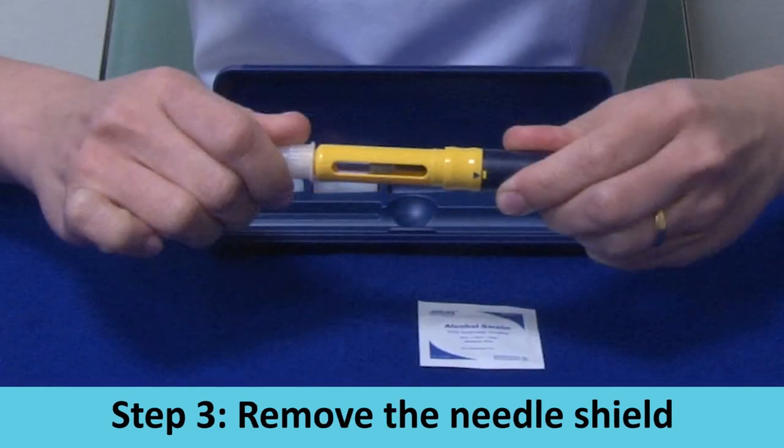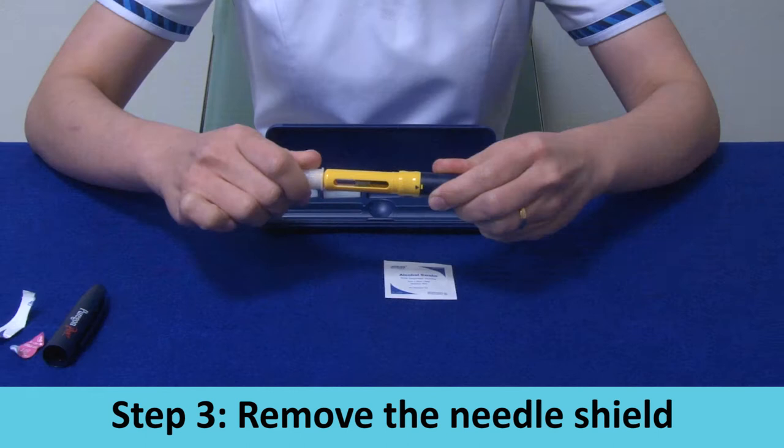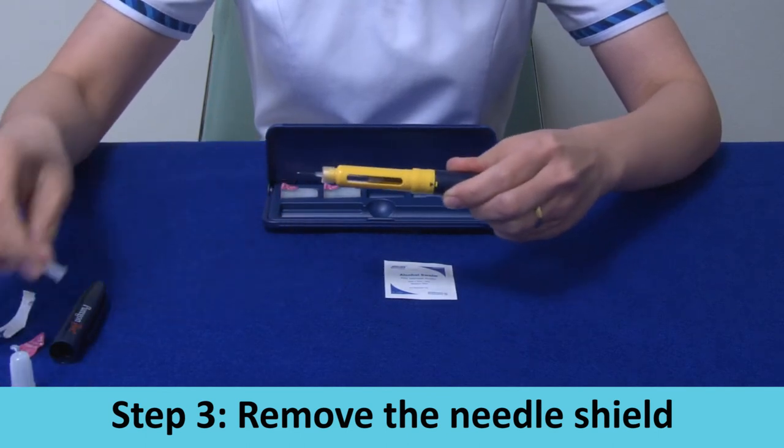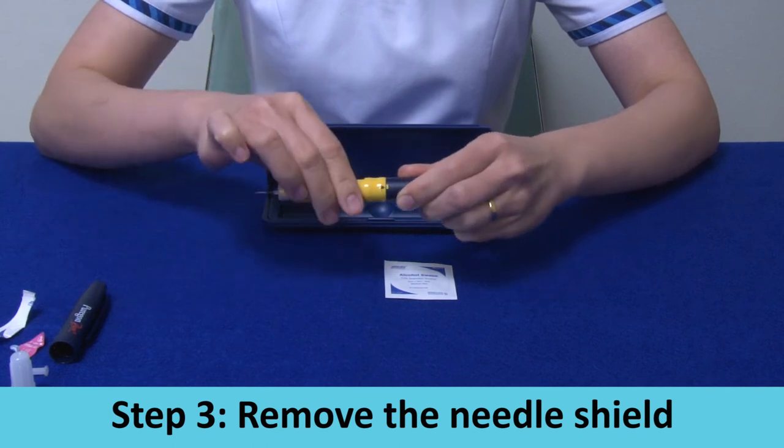Step 3: Remove the needle shield. Remove the outer needle cap by pulling it gently and keeping it for later. Then expose the needle by removing the inner cap.